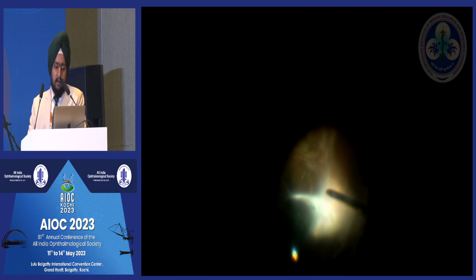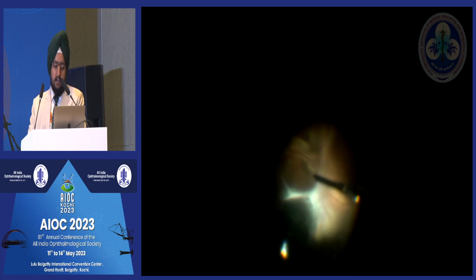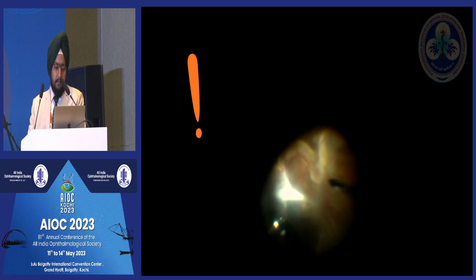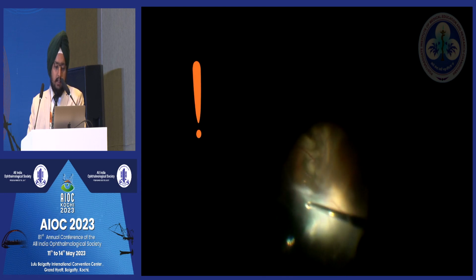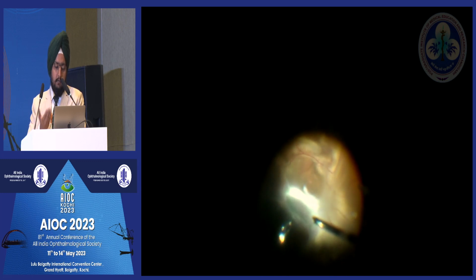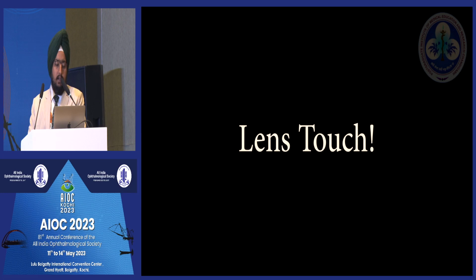And we started the vitrectomy trying to dissect the connections between the lifted ridge and the crystalline lens. And just notice my cutter port position here and what happened. So you can see what happened was a lens touch, because my cutter was facing directly towards the crystalline lens.